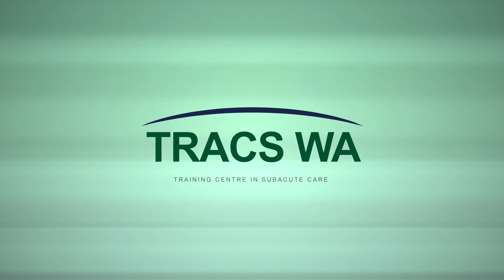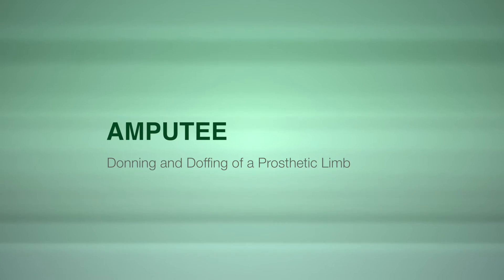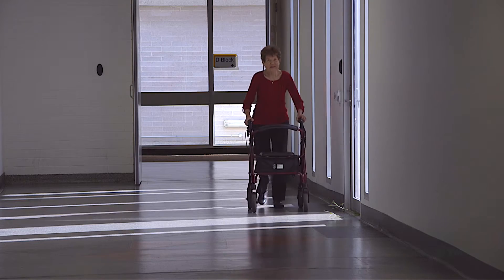This video is presented by TRACS WA Training Centre in Subacute Care. After her earlier consultations, Val is again meeting prosthetist Brendan Cahill to assess how she's progressing with the use of a new prosthetic limb.